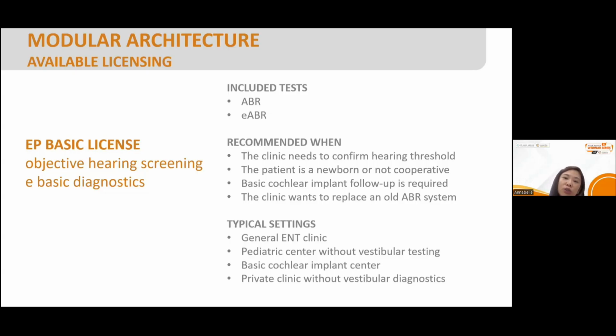Of course, they are not going to raise up their hand when they hear something. They can't really respond to the sound, they can't tell. So we have to do the automatic ABR for the hearing screening. If they pass, then we go to the normal pathway.